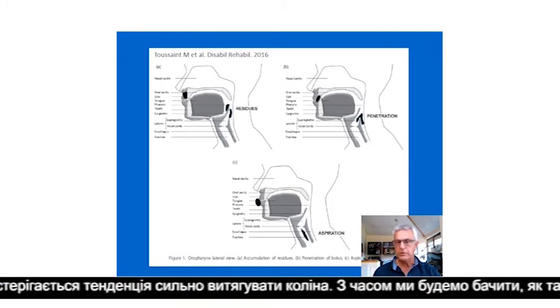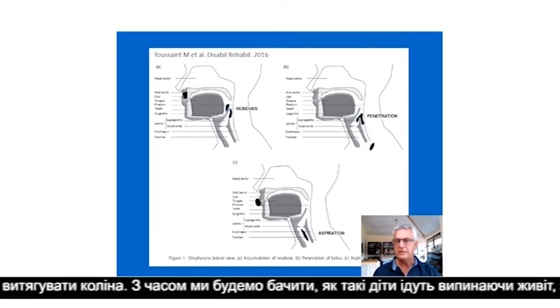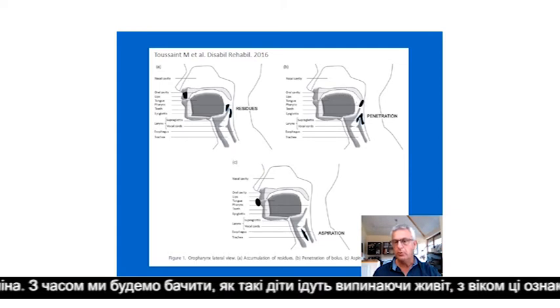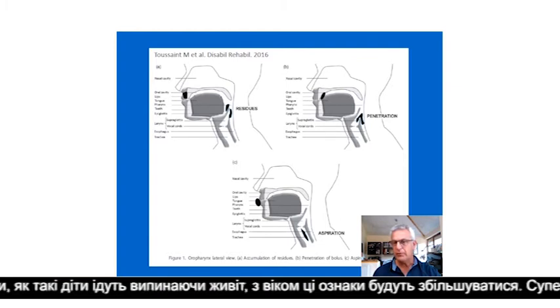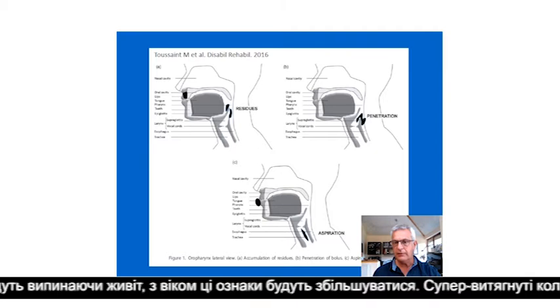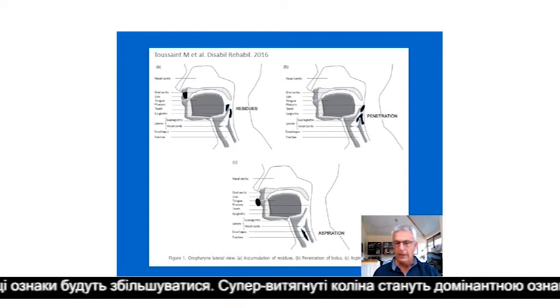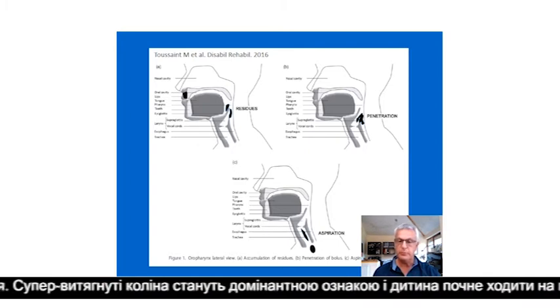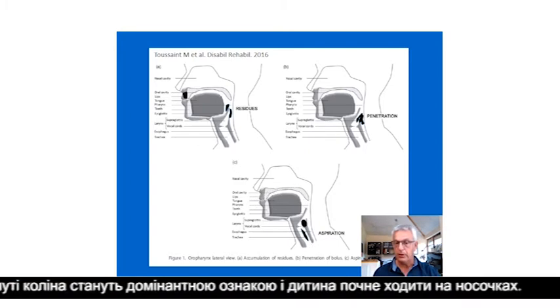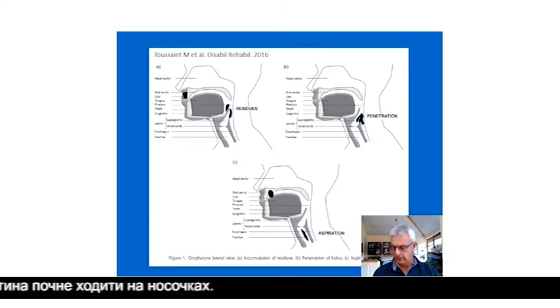A second possible problem is what we call penetration. Penetration is an incomplete aspiration. You clearly see that the bolus of food is taking the direction of the lungs, going in the direction of the vocal cords, but in the end it goes in the right direction into the stomach. And the worst problem is real aspiration. Aspiration means that the bolus, in total or partially, is going in the direction of the lungs, so it means that you have food in the lungs.